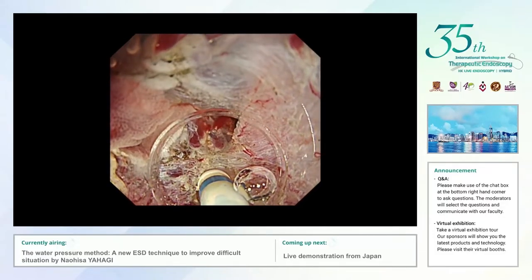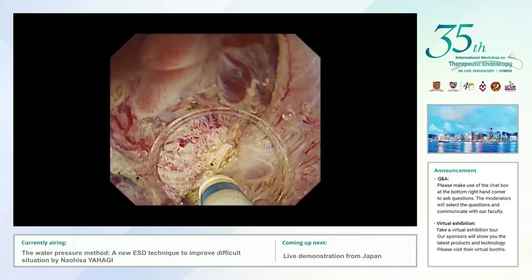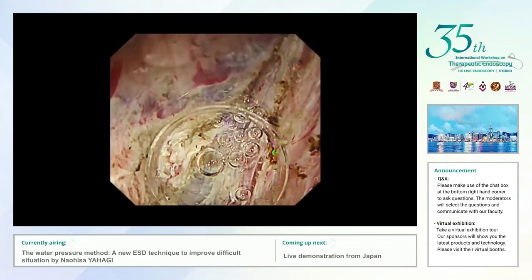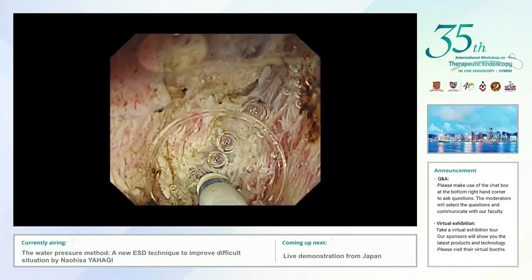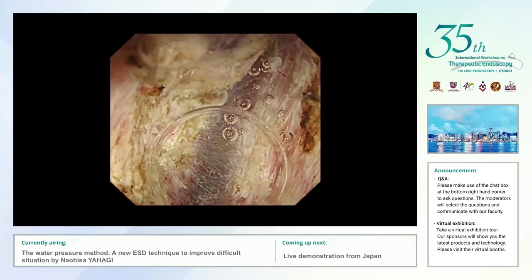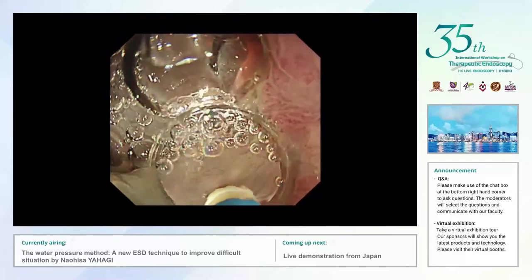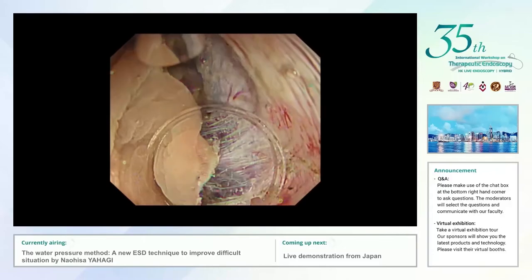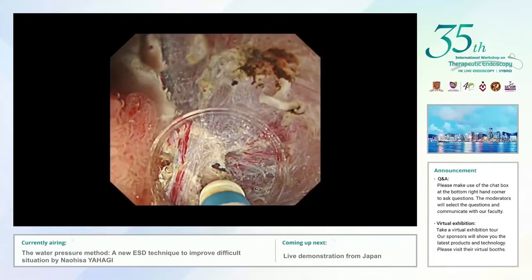I approached the fibrotic tissue using the metallic tip of the Dual knife J and carefully cut it using dry cut mode. It was very hard tissue but was possible to conduct submucosal dissection. Now we can see the open space under the fibrotic area. I again carefully conducted additional submucosal dissection through this area under direct vision utilizing the water pressure method, and finally completely cleared the fibrotic tissue. After the submucosal dissection, I continued the mucosal incision at the anal side to finalize the circumferential mucosal incision. I then restarted submucosal dissection for the remaining tissue, which was relatively smooth using the water pressure method even in this very difficult situation.